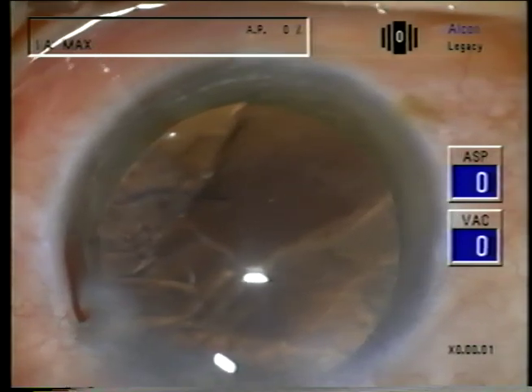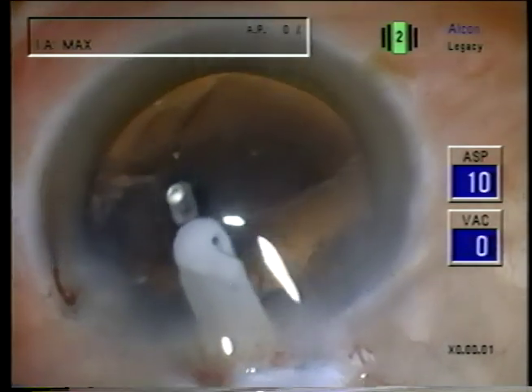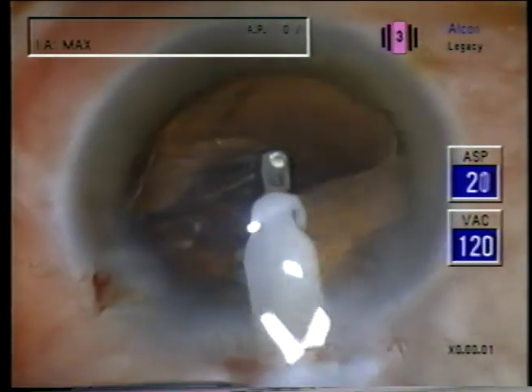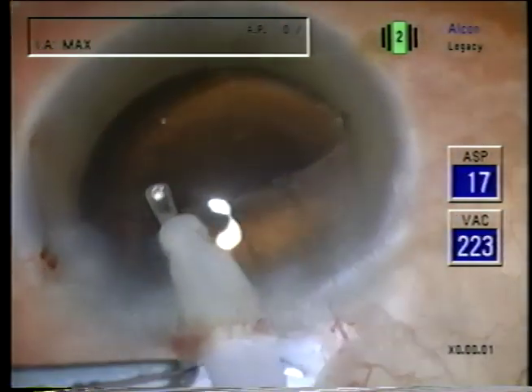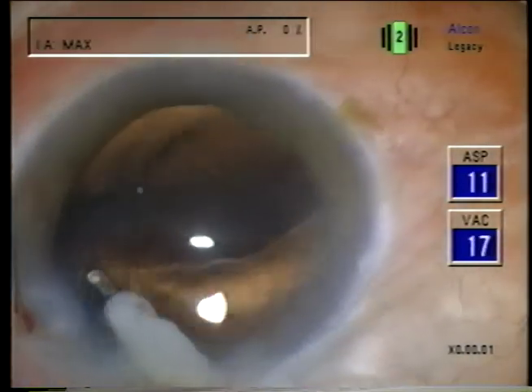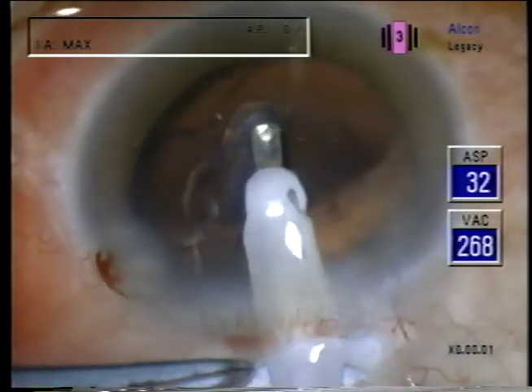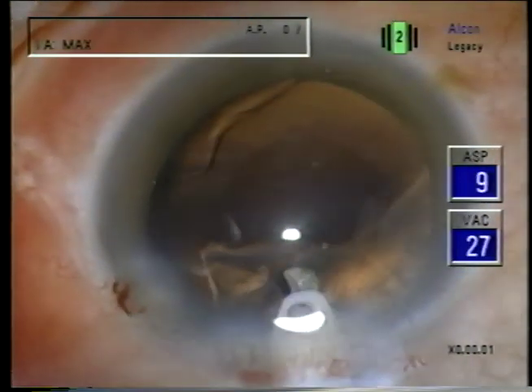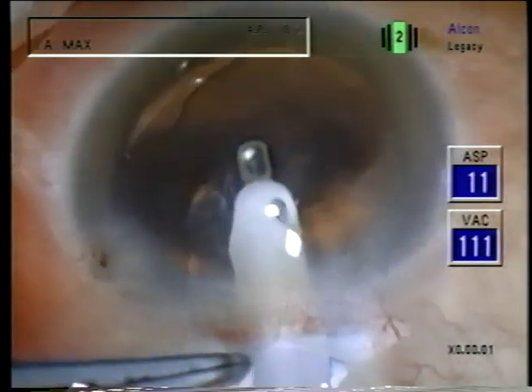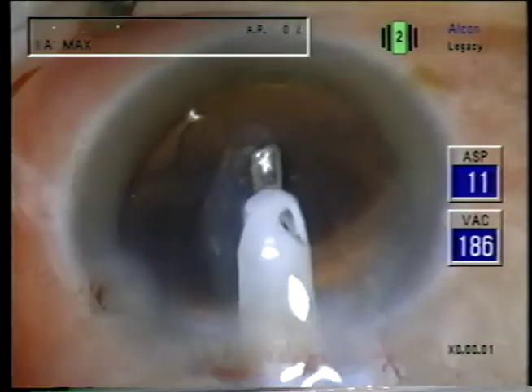I use a 0.3 IA tip and I use surgeon control of aspiration, which means that if I just barely touch the foot switch, I have a low aspiration flow rate. With a low aspiration flow rate, the vacuum rises very slowly. That makes it safe to react and vent in case the capsule is grasped, and it helps to avoid tearing the soft cortical material with too vigorous aspiration.